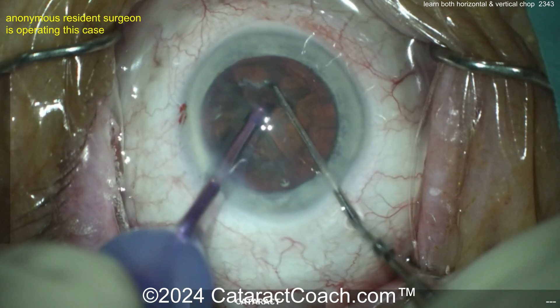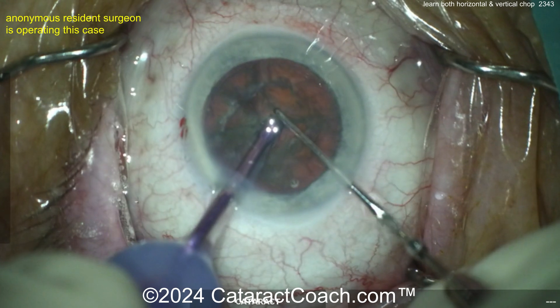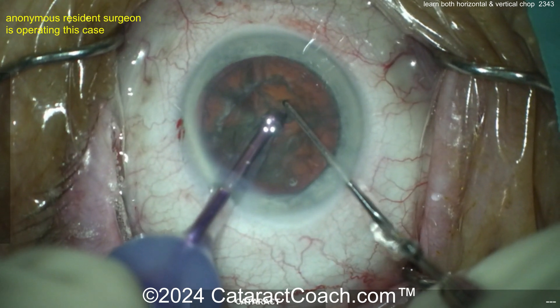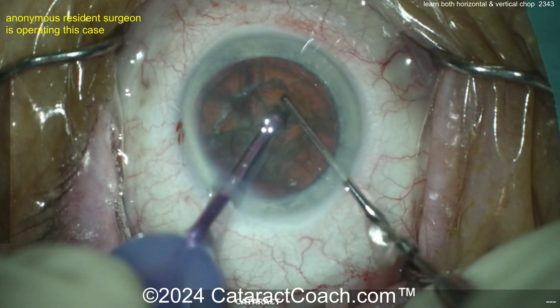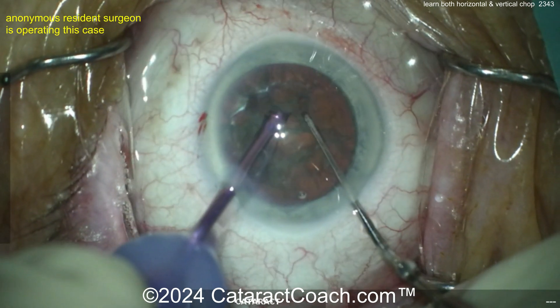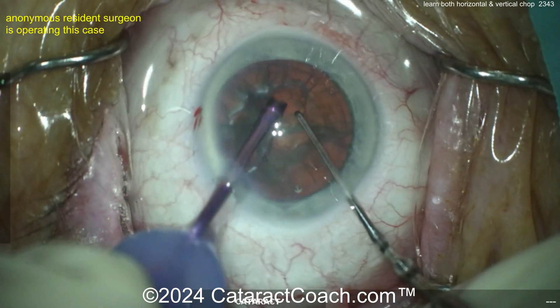Now it's a little harder to get a good purchase on that little piece. I'd rotate to get that bigger piece, buzz in, hold it with the vacuum — vacuum's high, chop, get the chopper in. The key with chop is you have a finite window of time to accomplish the chop.